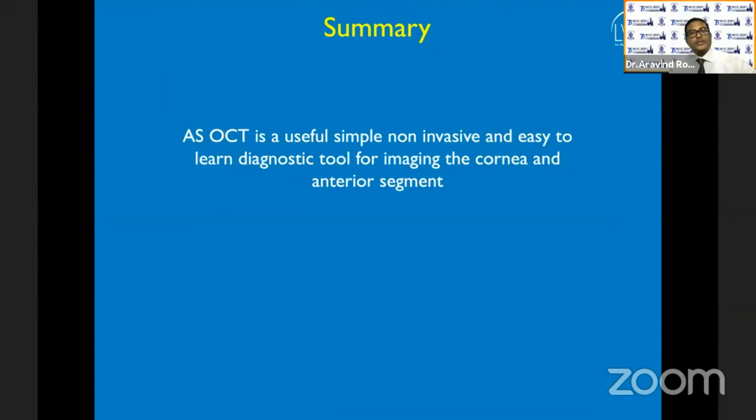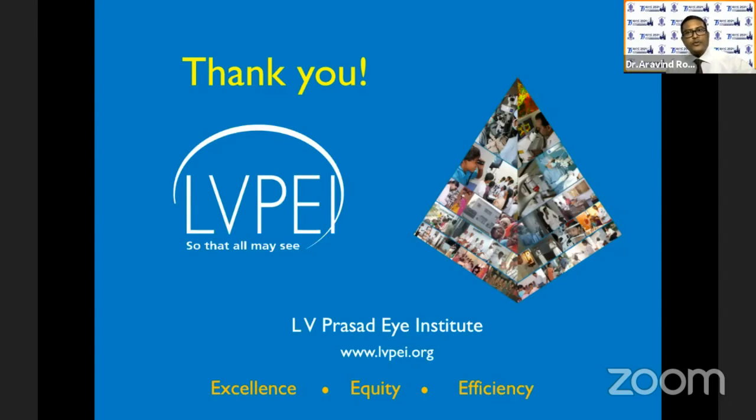All in all, the OCT is a very simple and useful, non-invasive way which can be administered as an office procedure and can be used for a wide variety of corneal and anterior segment diseases, and it also has a multitude of research applications.